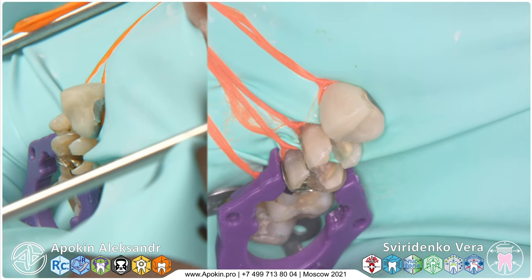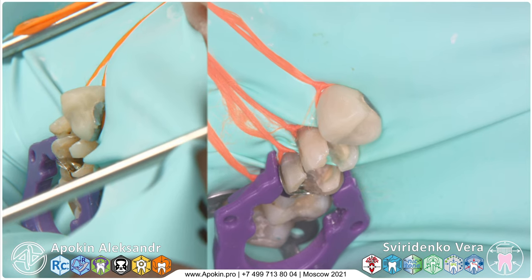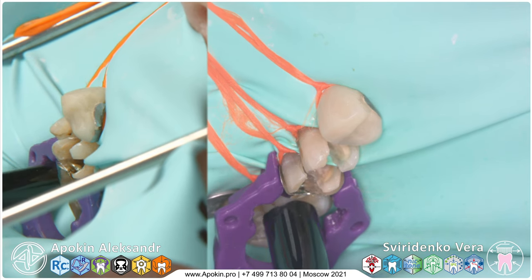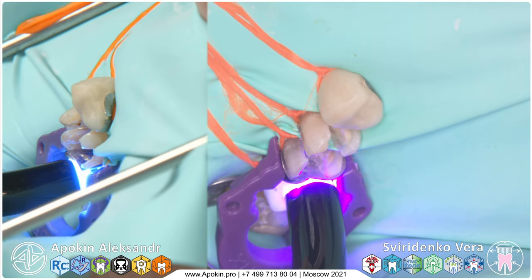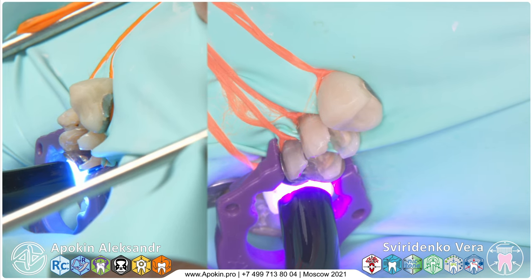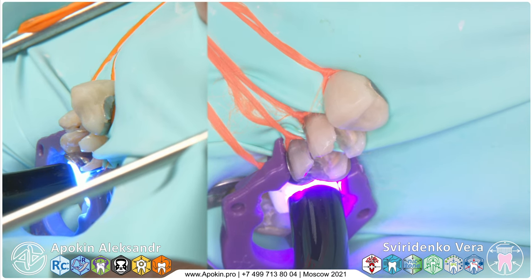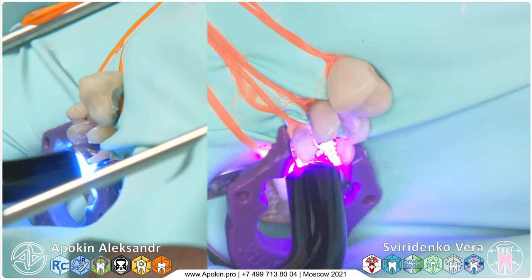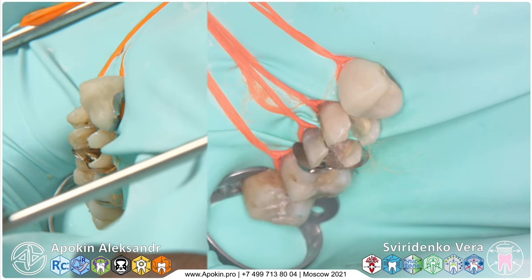When you are making very many proximal walls simultaneously, don't hurry. Make only one at one time. Then remove the ring, remove one matrix, so that in the interdental space we have the thickness of only one matrix. This wall is ready. Remove matrix holder ring.